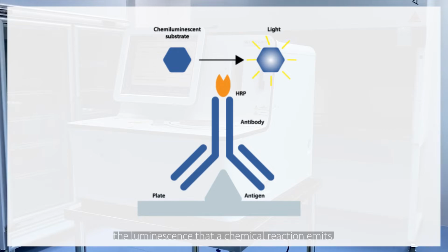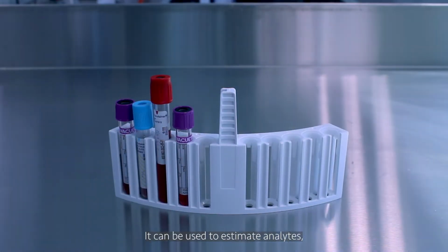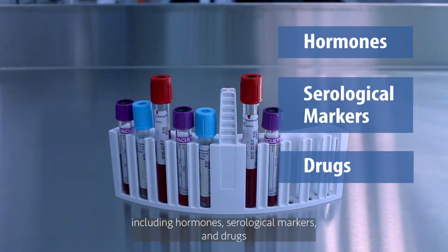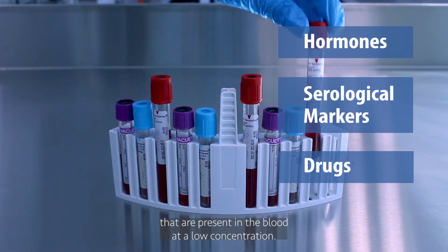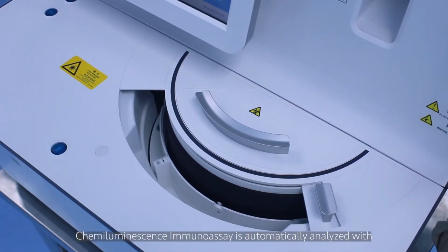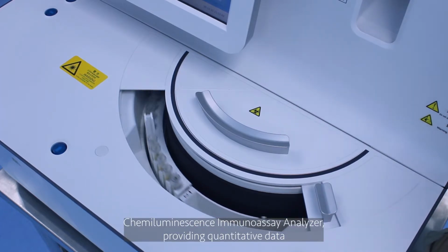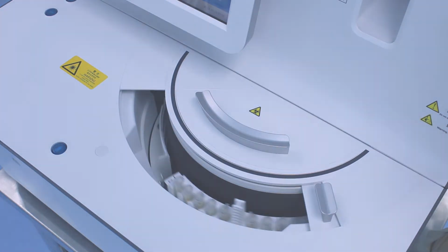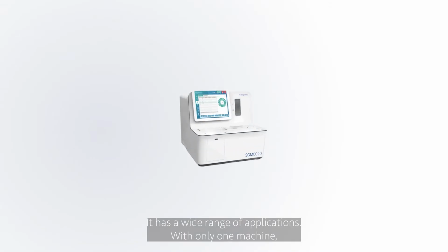Chemiluminescence immunoassay is a method to determine the concentration of a sample according to the intensity of the luminescence that a chemical reaction emits. It can be used to estimate analytes, including hormones, serological markers, and drugs that are present in the blood at a low concentration. Chemiluminescence immunoassay is automatically analyzed with a chemiluminescence immunoassay analyzer, providing quantitative data for fast and effective disease management. It has a wide range of applications.